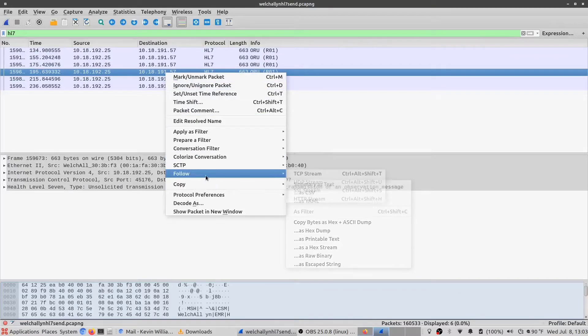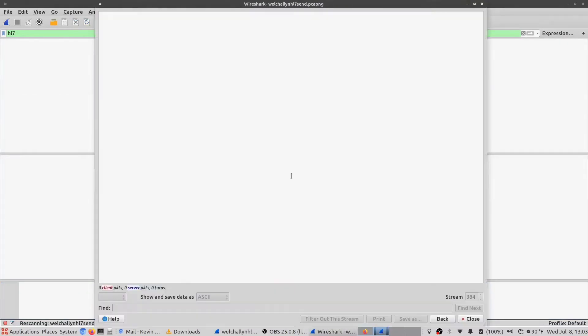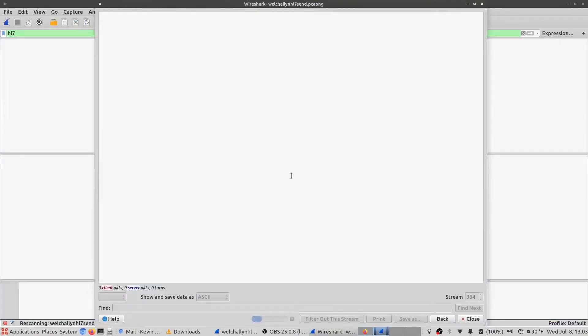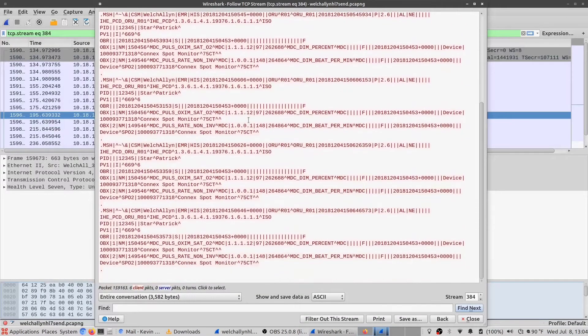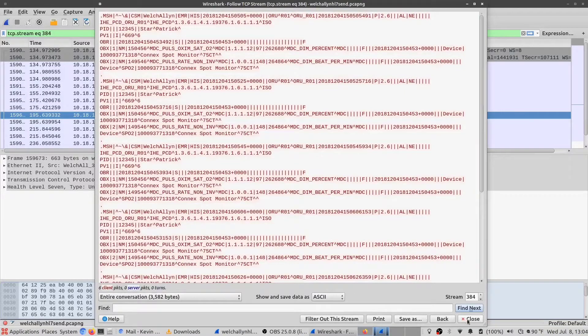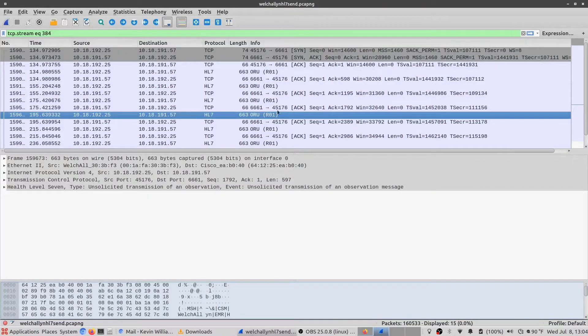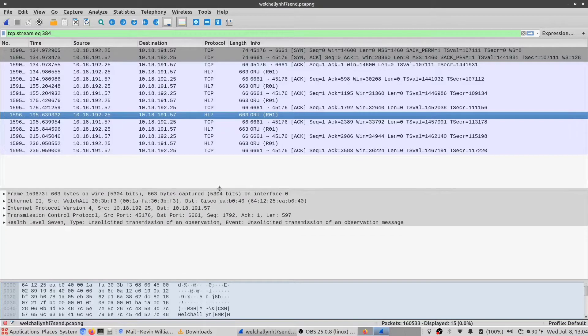So if we follow the TCP stream, not only will we be able to see the raw HL7 message in its uninterpreted form, but if we click close down at the bottom here, we can see that Wireshark has actually pulled the context of that information.